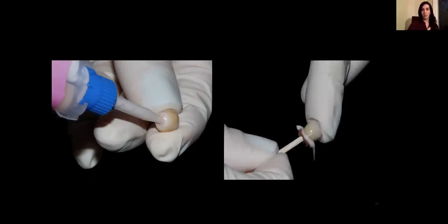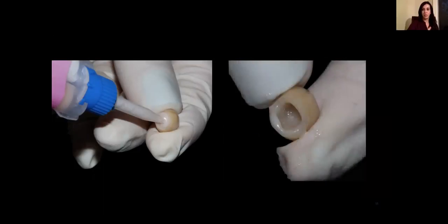We place the cement inside the crown, and then we just seat the crown on this duplicate abutment, and you can see all the extrusion of the cement through the crown. And then you simply lift off the crown, and you can see that inside, a very nice, thin, even layer of cement is present in the intaglio surface of the crown.